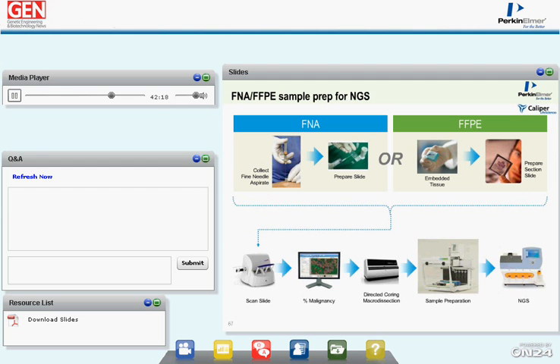So this slide captures how we're looking at the overall workflow. Samples come in as either FNAs, or fine needle aspirates, or core biopsies or resections. It's usually the latter. Next, the challenge is to remove tumor-rich material from the block or the slide. And then once that material has been selected, understanding what the percent malignancy of the material is, as Mike discussed earlier.